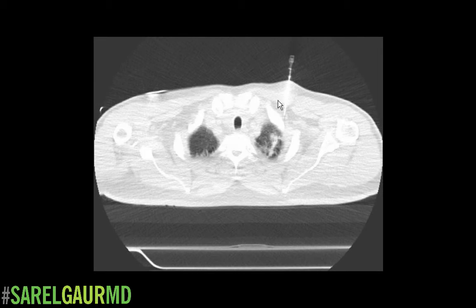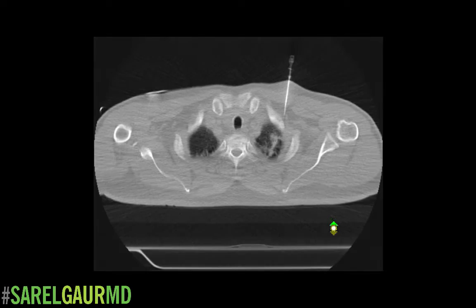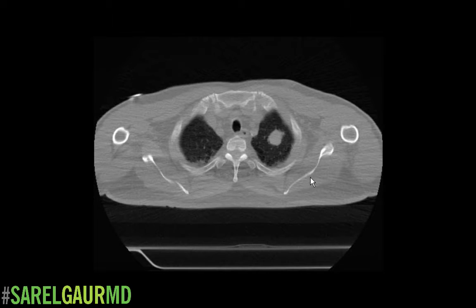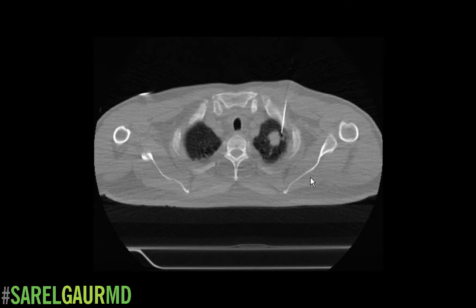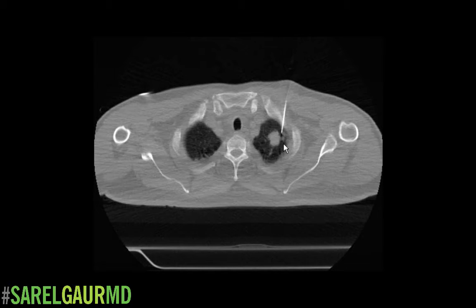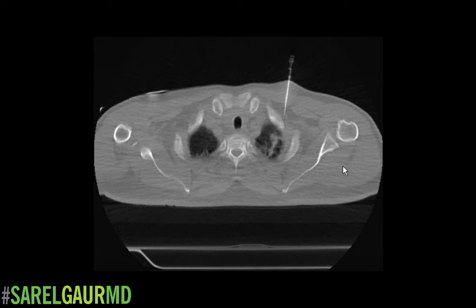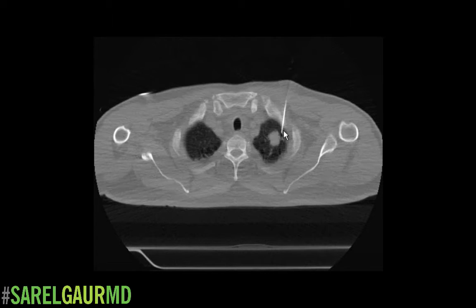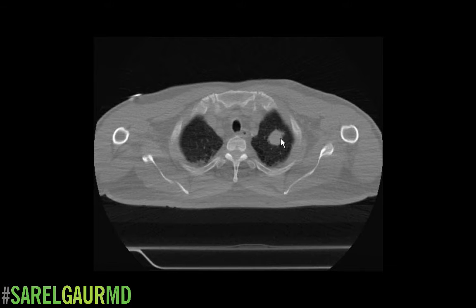Here's another scan, and you can see that we're advancing that needle towards the nodule. As we're advancing, we'll do a few scans in between to make sure we're on target. If we're not on target, we'll go ahead and adjust the needle to make sure we're going towards that nodule.